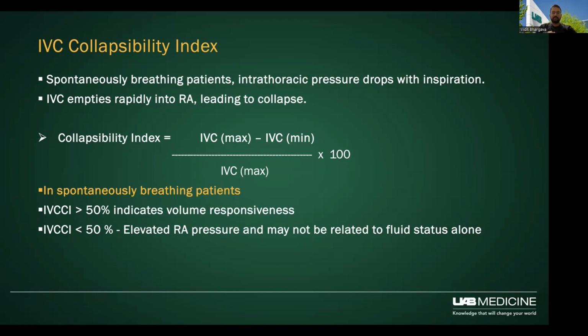I think there is some value to using IVC collapsibility index in extremes of values. So greater than 50% for me is an extreme of value in deciding if I should give this patient some fluid, and is it likely to cause an increase in their cardiac output.